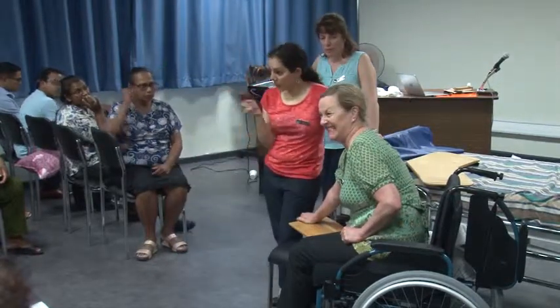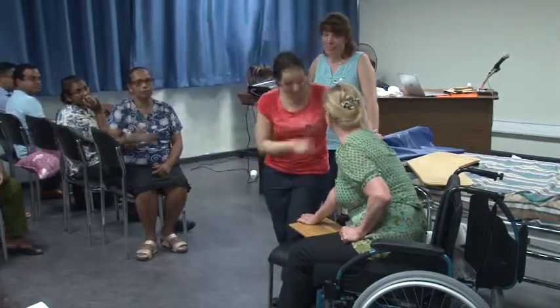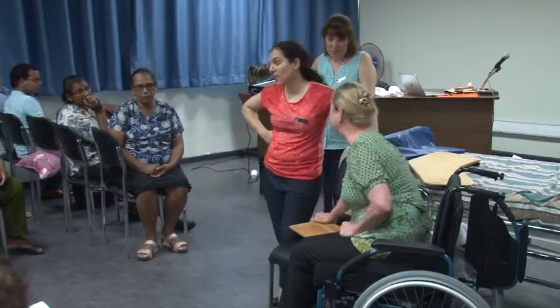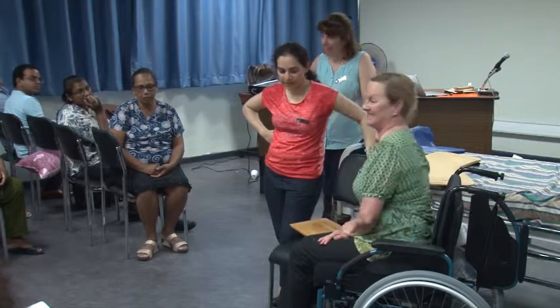And that's the other common thing. Keep your fingers clear, because they will hurt their fingers and squash the fingers. So that's a basic slide board technique. Yeah, that's okay. The catheter, you need to get it out of the way, that's fine.